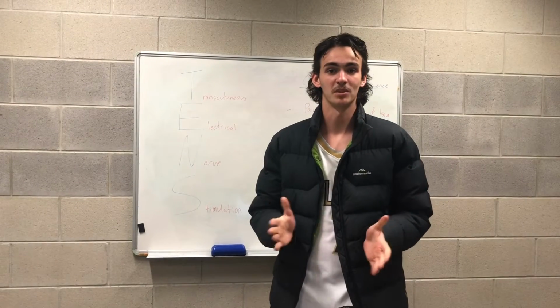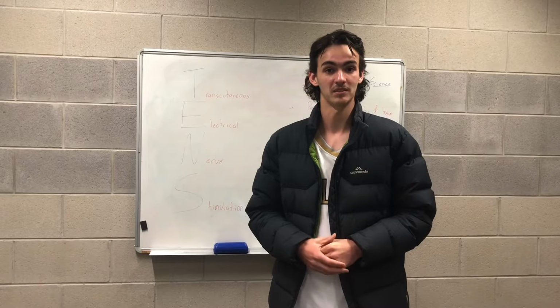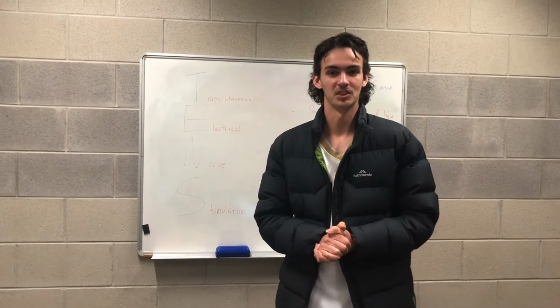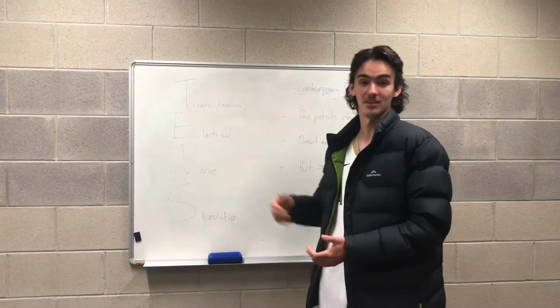Throughout this assignment, I'm going to be referring to the example of Gertrude, the 34-year-old woman who's in her third trimester of her pregnancy, who is aiming to utilise a TENS machine to assist with pain relief while she goes through labour. Right, so just for starters, this is the definition of a TENS machine.